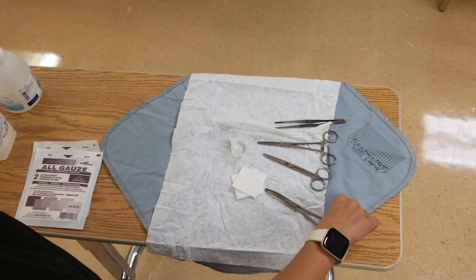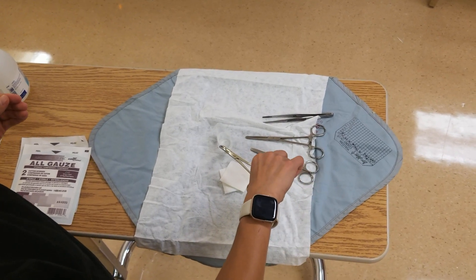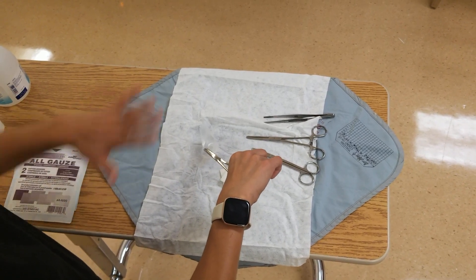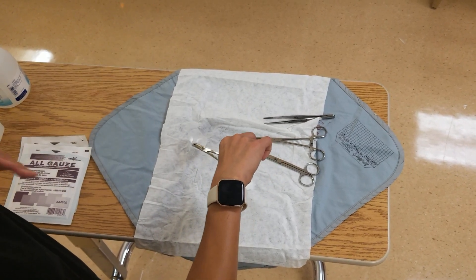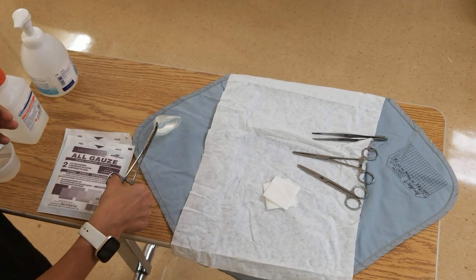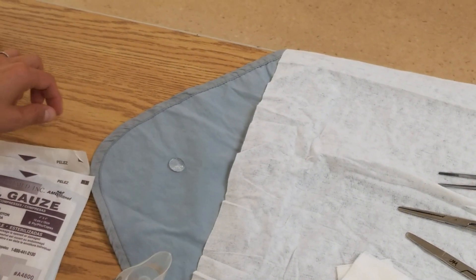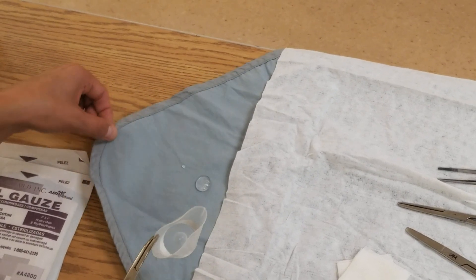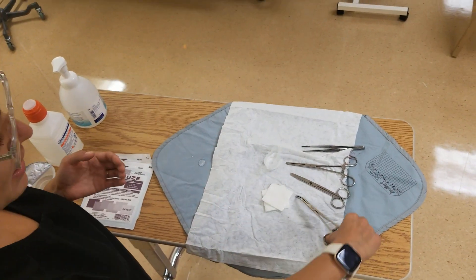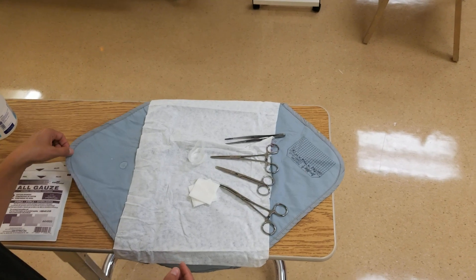One other difference to highlight: with our disposable kits you don't want to get the sterile field wet at all. With this reusable kit you also don't necessarily want to get it wet, but it is a little more impermeable to water. The water doesn't actually soak through, so it can get little drops on it and it's not as big of an issue as with disposable kits, where it absorbs microorganisms through the table.